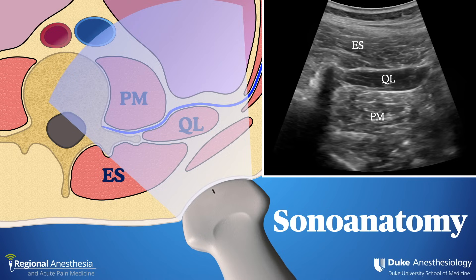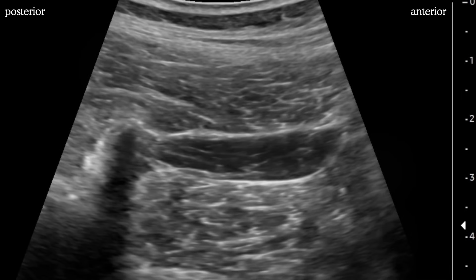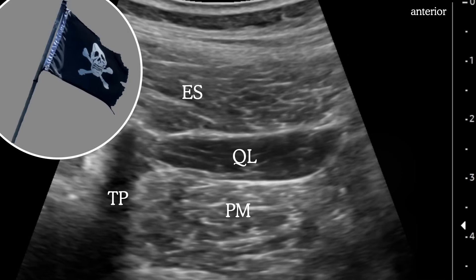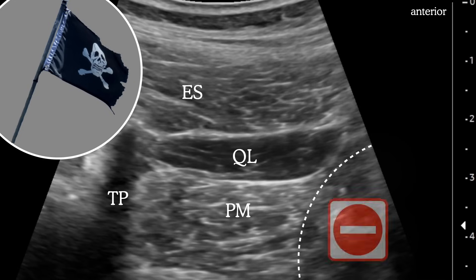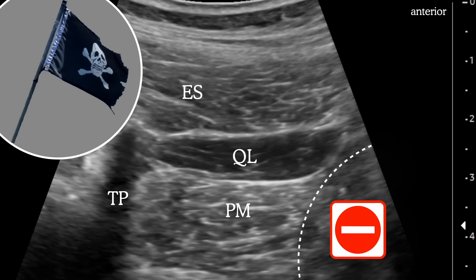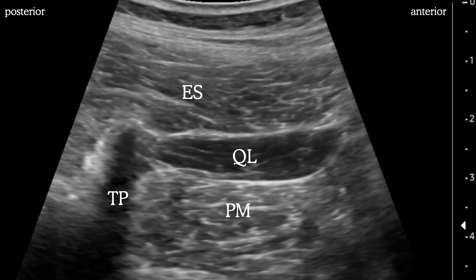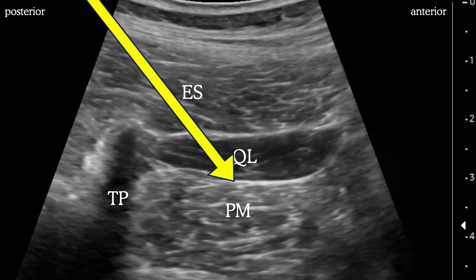Here's a typical QL sonogram with the ultrasound beam directed obliquely at the paraspinal structures. We see the QL muscle extending laterally off the transverse process with the psoas deep to it. The QL usually looks like a flag flying from the flagpole of the TP. Further anterior and deeper, you'll appreciate motion associated with the retroperitoneum — sometimes the kidney can be observed bobbing in and out of the picture. Suffice it to say, that's a no-fly zone. The target fascial plane is usually quite bright because of its perpendicular orientation to the beam, and the needle will be advanced from the medial or posterior aspect.